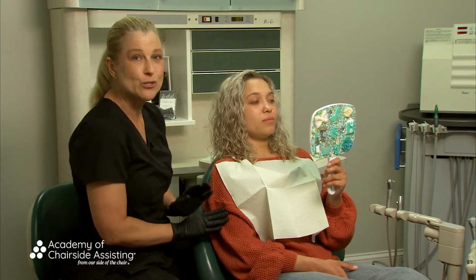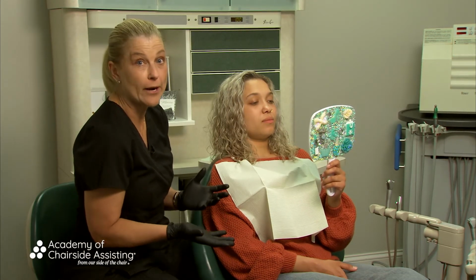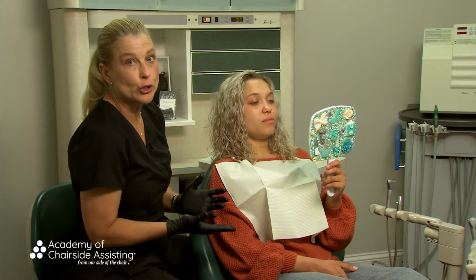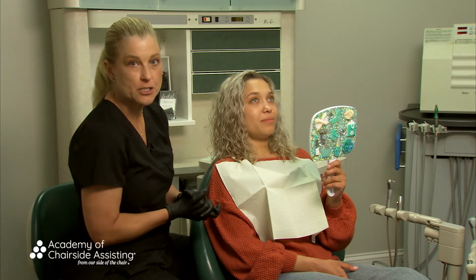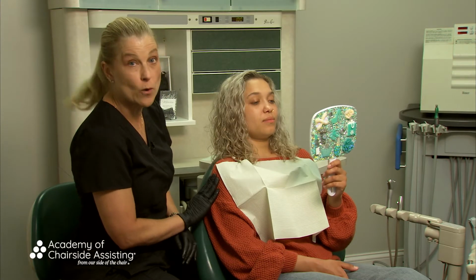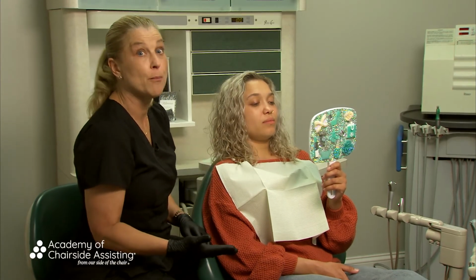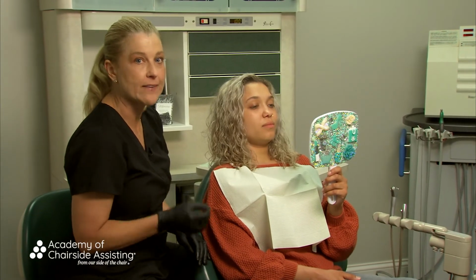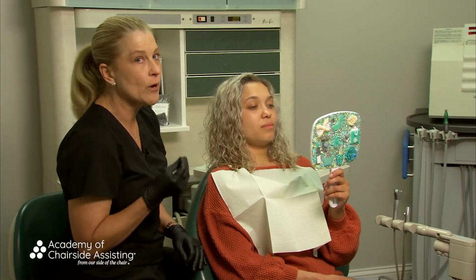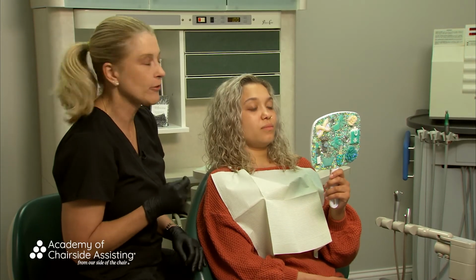Remember, Haley had no sensitivity, and now with the added potassium nitrate, she really could wear it a little bit longer. But again, we want to really stick to the directions, and it says 15 to 20 minutes. So she'll do this for 20 minutes here in my chair, and then start the second tray tomorrow, every day for 7 days. This is so important, making sure that patients do not skip a day, every day.